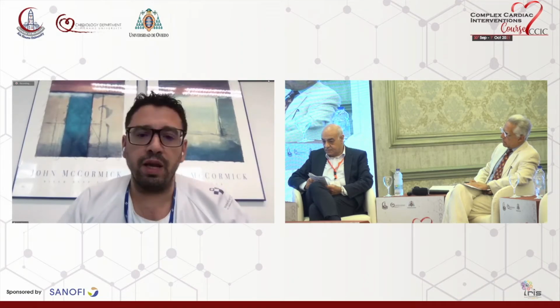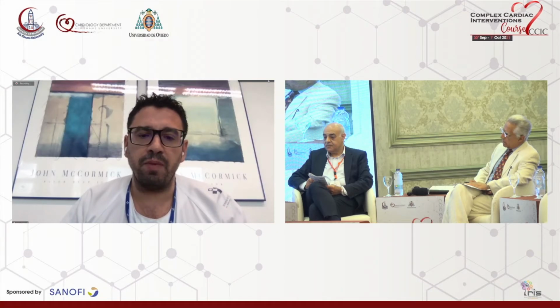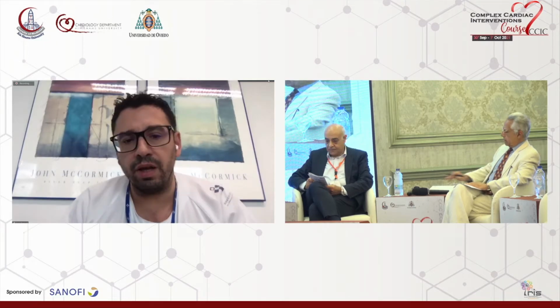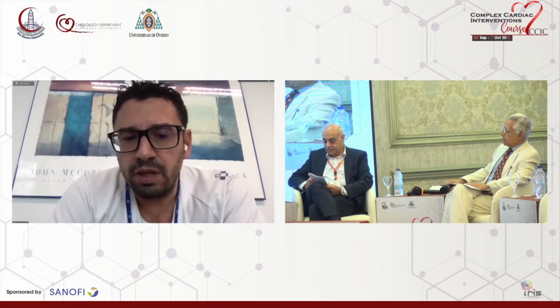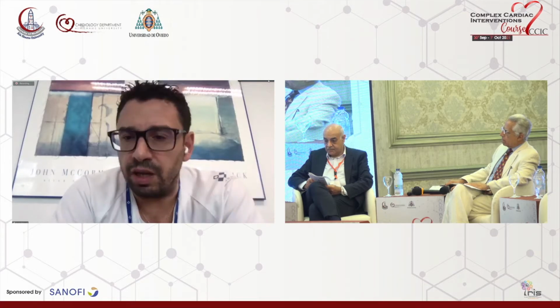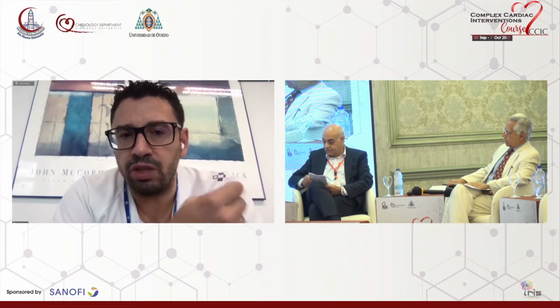For sure, you can use other tools for avoiding this. If you perform a CT scan in a very long CTO, you can predict the direction of the retrograde approach with proper decision. So many times, if we have doubts, we perform a soft first antegrade attempt, not more than 20 or 25 minutes, and then we proceed with retrograde. If the case is a second attempt, meaning we failed in the first attempt and we are approaching the CTO with a second attempt, we always go retrograde.